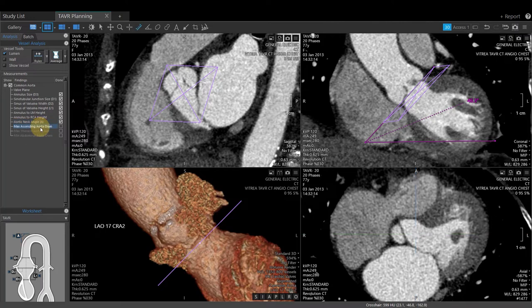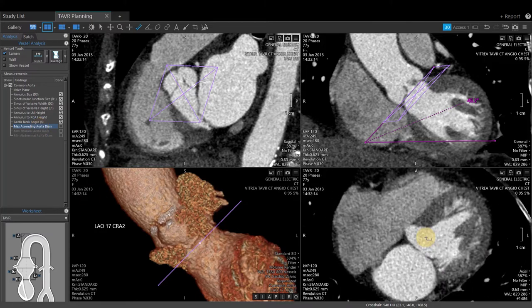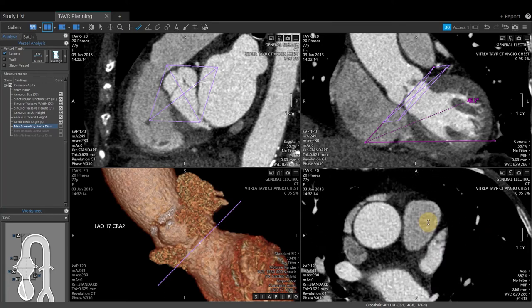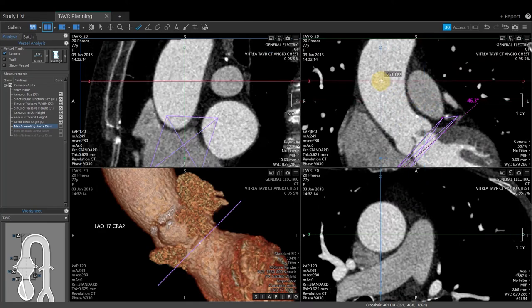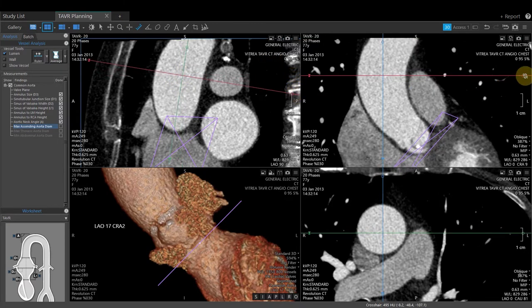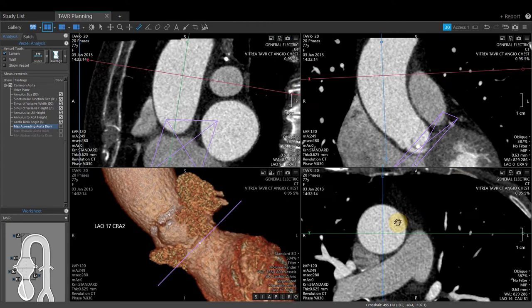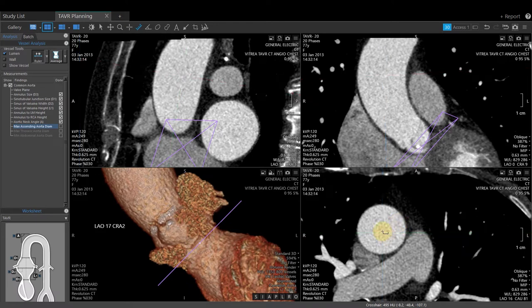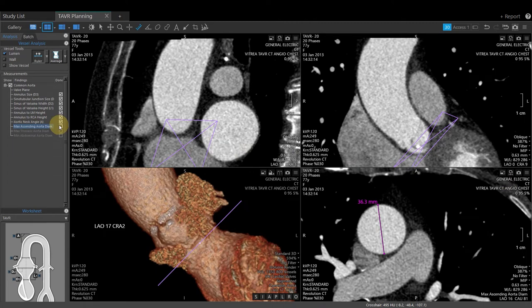Maximum ascending aorta diameter is the next measurement. This can be created in the 2D images or in the vessel probed view. Roll the center wheel to navigate through the data. Holding the left ALT key activates the crosshair. Click and drag the crosshair to the maximum diameter of the ascending aorta, obliquing as needed. Once at the maximum ascending aorta diameter, release ALT and double-click in the aorta. The software will automatically drop a ruler tool. Edit if necessary, then click Done and click the camera to save.